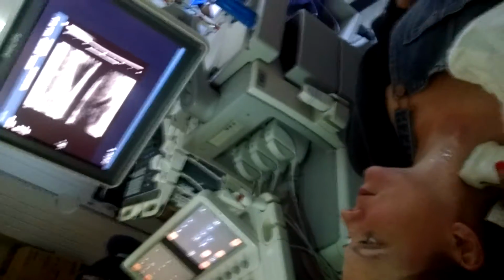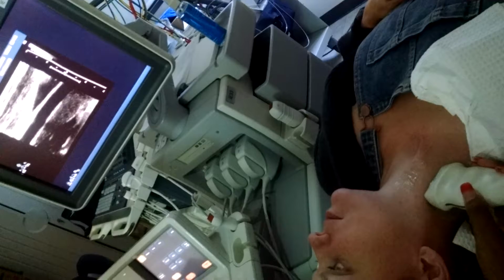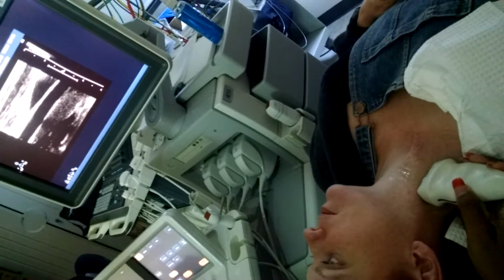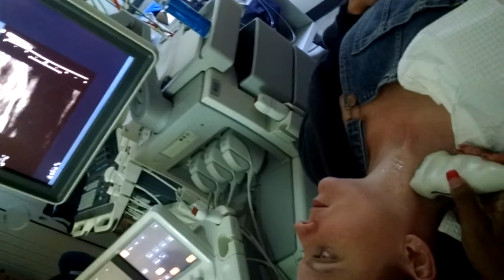I'm going to put it on. There, that's better. What are you changing? I put on harmonics. The jugular's compressed, right? Right there.